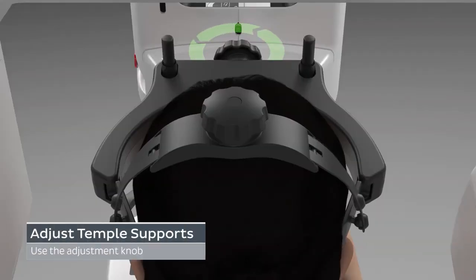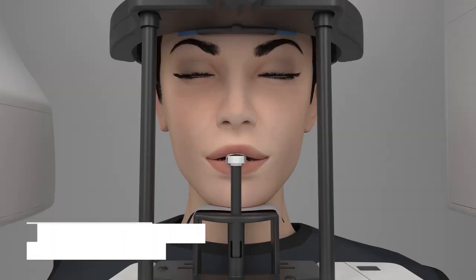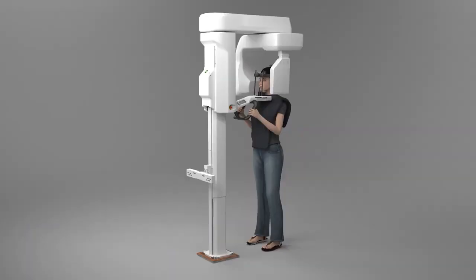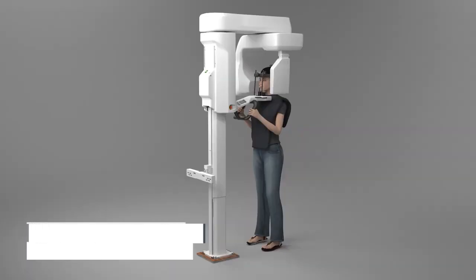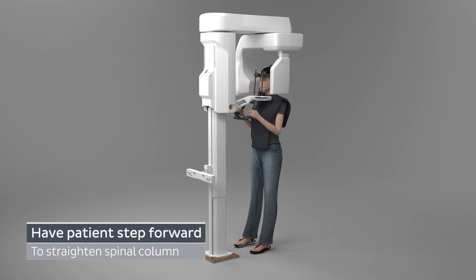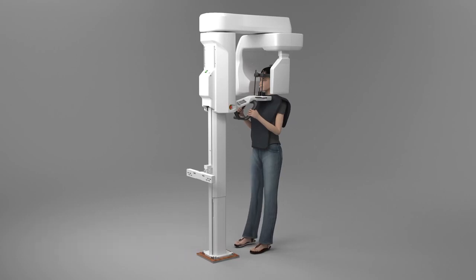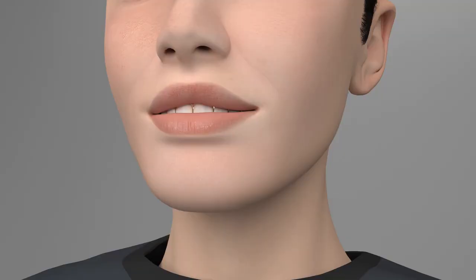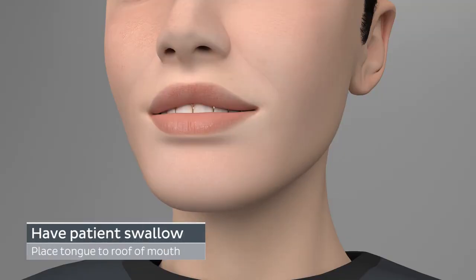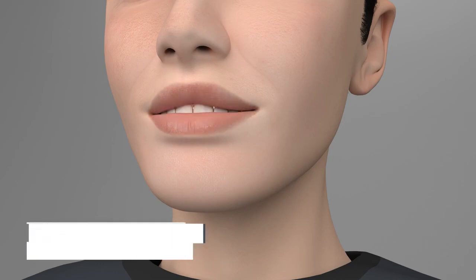Adjust the temple supports using the adjustment knob. Reconfirm proper patient alignment using the positioning lights. Ask the patient to take one step forward to straighten the spinal column. The patient is now slightly leaning backwards and should remain this way during image acquisition. Ask the patient to swallow, place the tongue to the roof of the mouth, and remain still for the duration of the exposure.